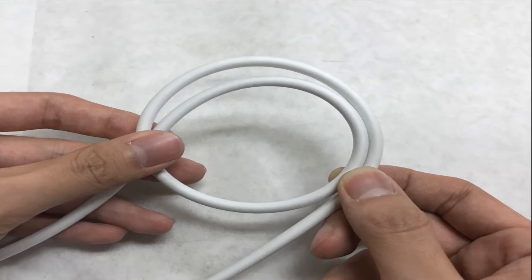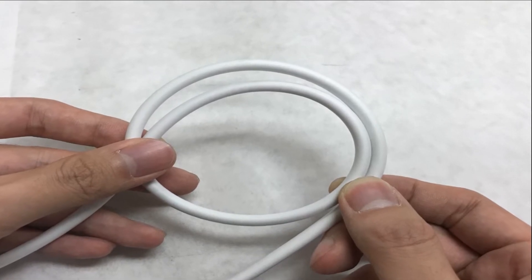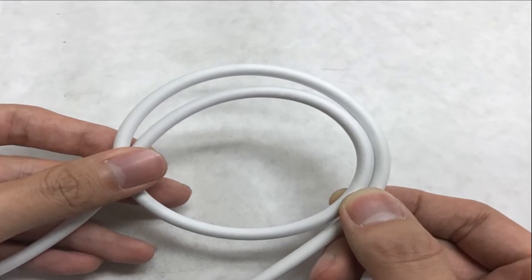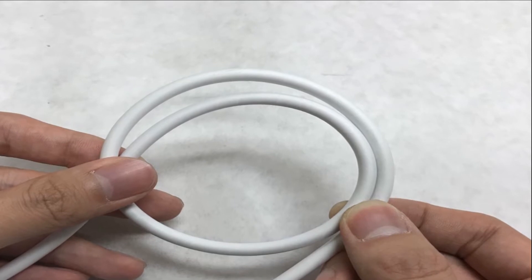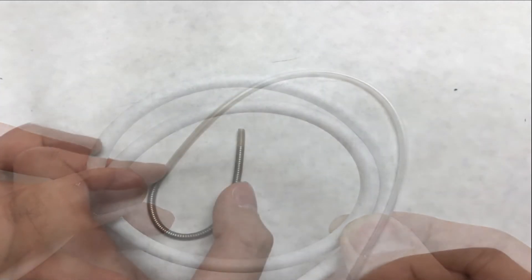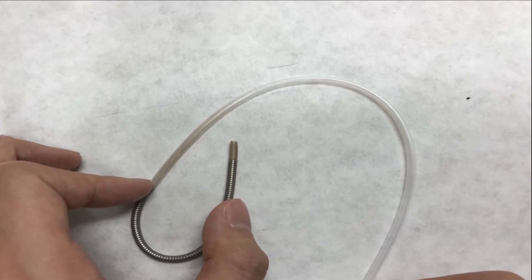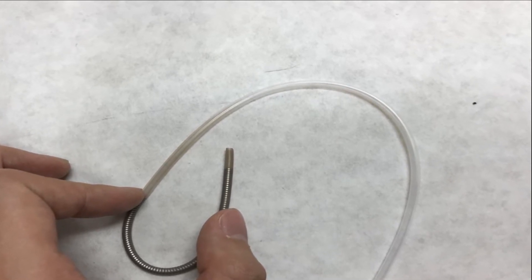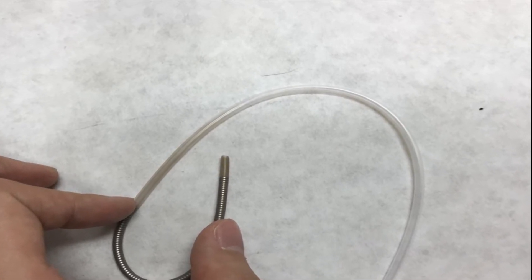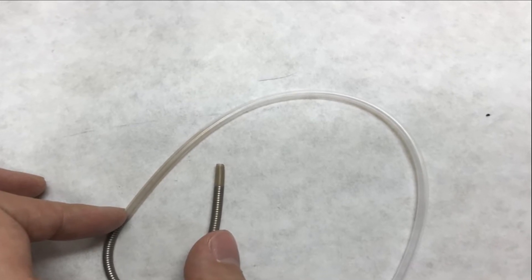The first factor is flexibility. For example, a 3.7 mm channel for colonoscopies needs to be able to bend 180 degrees in a radius of 25 mm. Different models require different levels of flexibility as well. Smaller models, for example, need to be able to bend up to 275 degrees in a 20 mm radius.